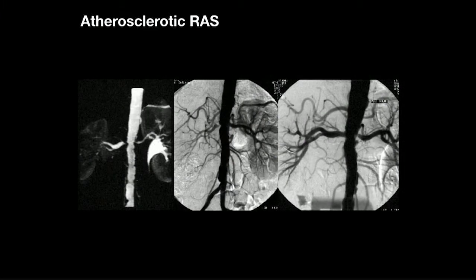There's not enough blood getting in that, it doesn't look wet enough. So I went in, this is one of the last interventions I did. I gave up IR about 6-7 years ago now, maybe more, I don't know. But this is one that I did. This patient came with an unrecordable blood pressure into hospital. By unrecordable, it meant it's over 300 millimeters systolic, and these modern digital machines don't actually go above 300. They couldn't measure her blood pressure.